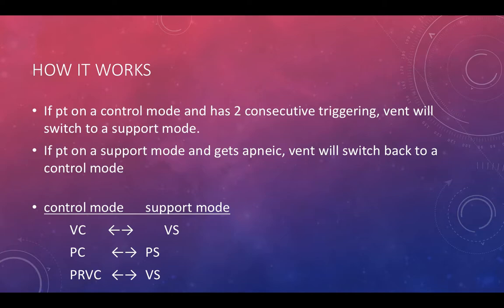Okay, when the patient is on volume control, the support mode will be switched to volume support. Pressure control will be switched to pressure support. PRVC will be switched to volume support.